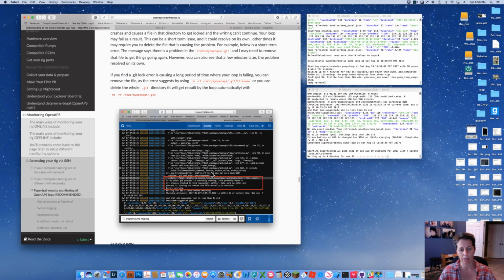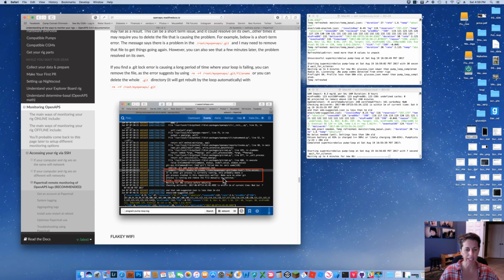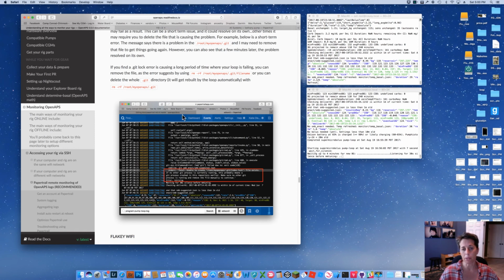But one of the other common error messages talks about being unable to create a .git index lock file exists, you need to delete it or make sure no other processes are running. When you see these file callouts that go on and on and on in the pump loop, and then at the end will be predominantly the error message, the git lock is a really simple issue to fix.